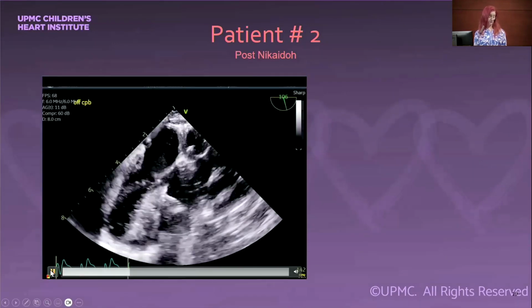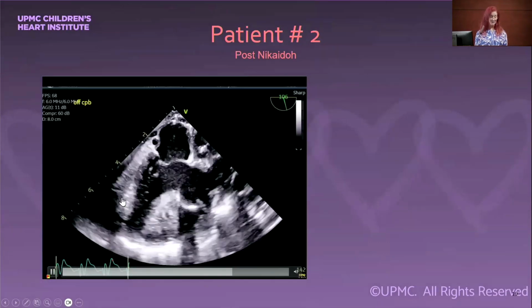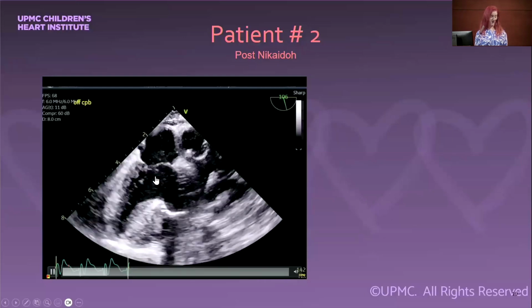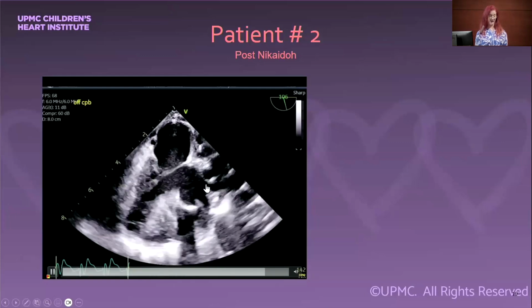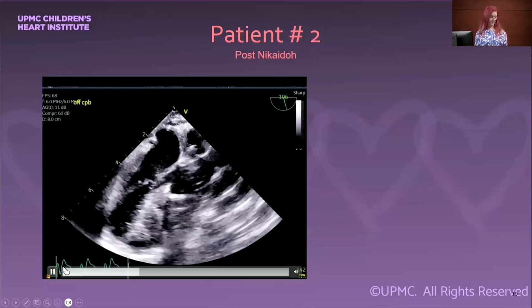I actually was lucky enough to do both these pre and post-op TEs, and this is utterly amazing to me still. So here is your LA, here's your anterior leaflet of the mitral valve, here is your LV, here's the native septum, here's your VSD patch, and here's your translocated aortic valve. There is no tissue there. It is wide open. Still amazed that that worked.